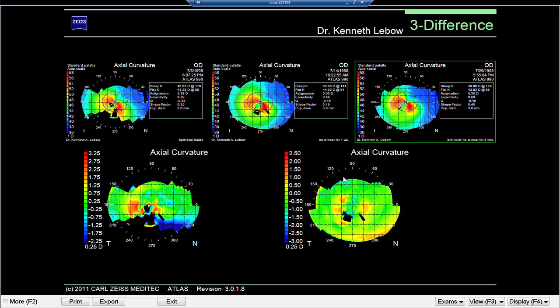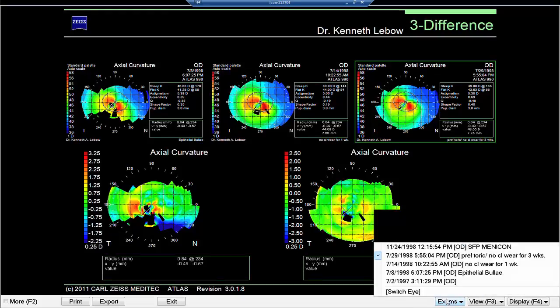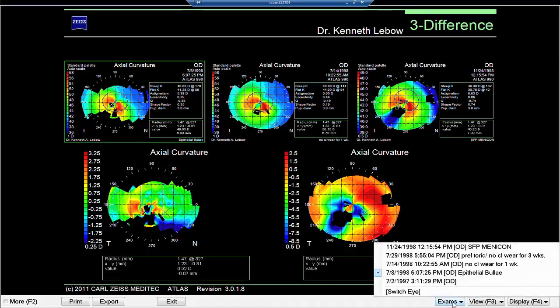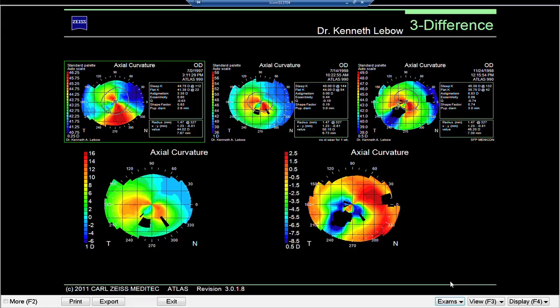We eventually fit a contact lens on this patient. Looking at the topography: the initial exam, the development of keratoconus, and the difference map clearly showing the development of keratoconus associated with corneal thinning. We made the diagnosis of keratoconus and fit a contact lens to that eye. You can see this area of flattening — the reason some areas are black is because the rings were distorted — but this has flattened as a result of the contact lens being placed on the eye.